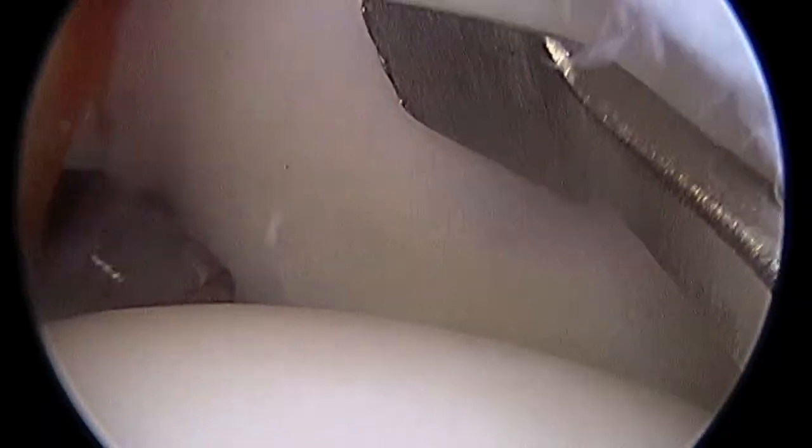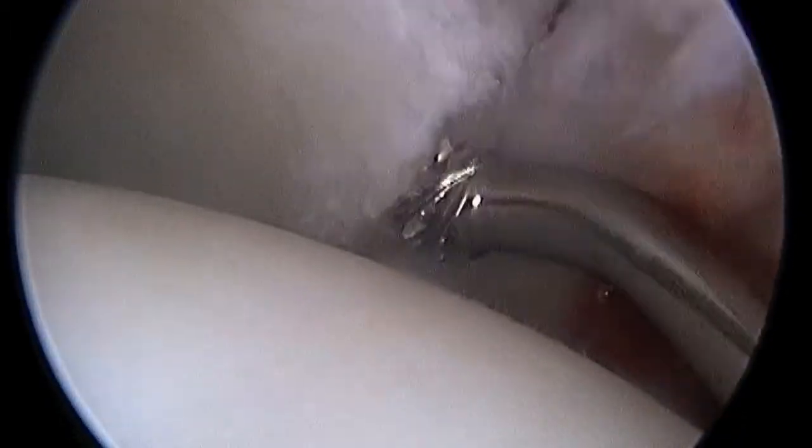Here you can see again mobilizing that labral complex using an elevator. This is the view from above now — this is a lot like that diagram you saw earlier of a shoulder dislocation. The glenoid or cup is at the top of your screen, and the ball of the shoulder is at the bottom. And there you see me mobilizing the labrum and ligamentous complex, and again roughening up the bone to promote healing.